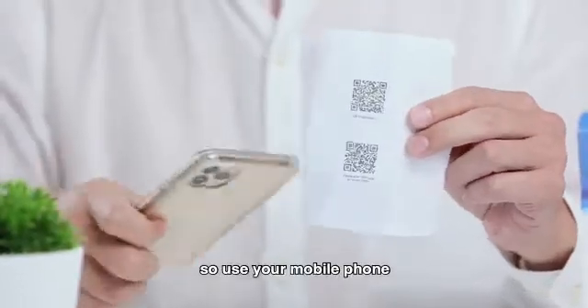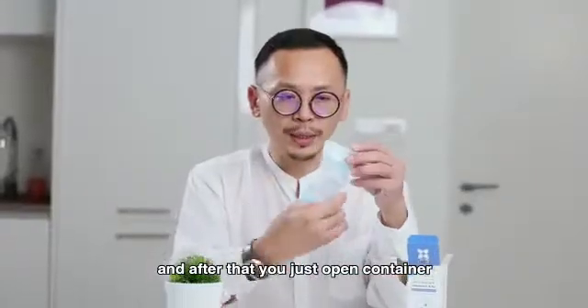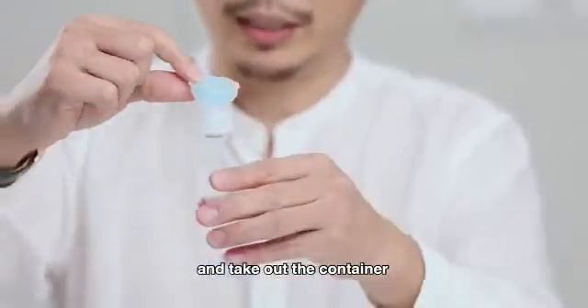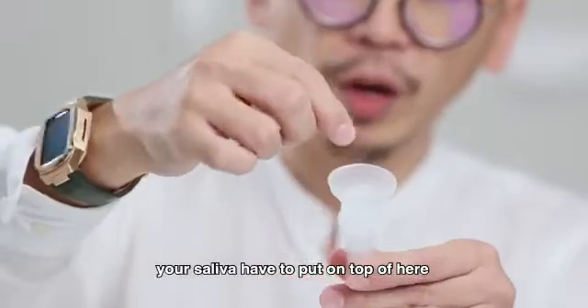Use your mobile phone to scan the QR code to register. And after that, you just open the container. Take out the container and remove the blue cap. Your saliva has to be put on top of here.